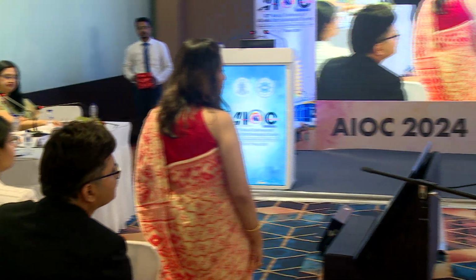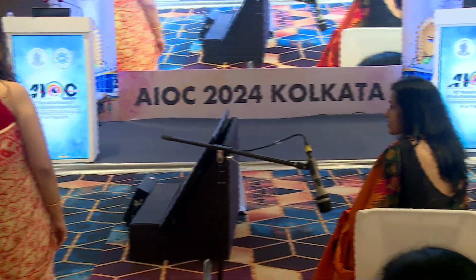If the child is on the myopic side and between 2 to 5, do you do PCC or? I do a PCC, sir. Vitrectomy, I might leave if I feel it's too liquefied, but PCC I'll still do. And Dr. Chatra, from the retina perspective, would you advise? Given the fact that they're still in the amblyogenic age group, we would still prefer that it's done, and if the anterior face is intact, better not to touch.